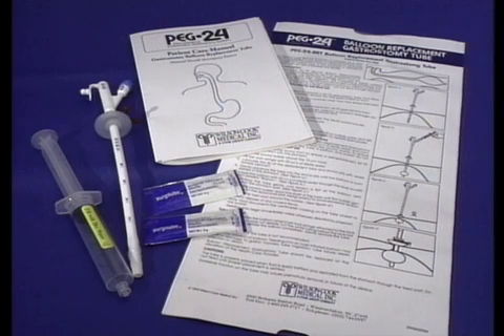A detailed patient care manual is included and should accompany the patient, as it provides necessary information for the caregiver.